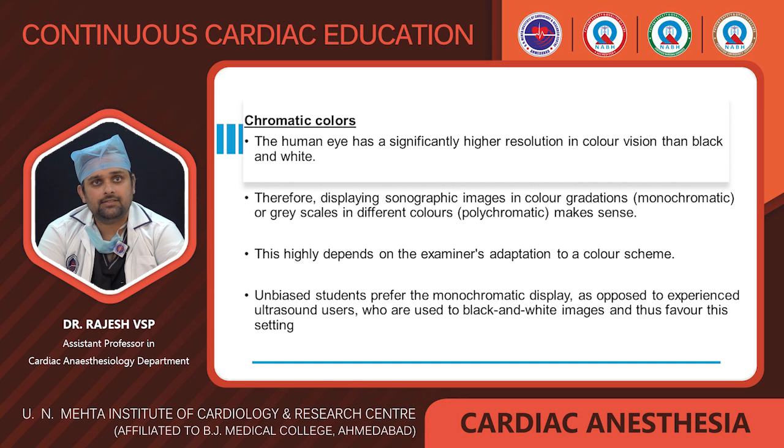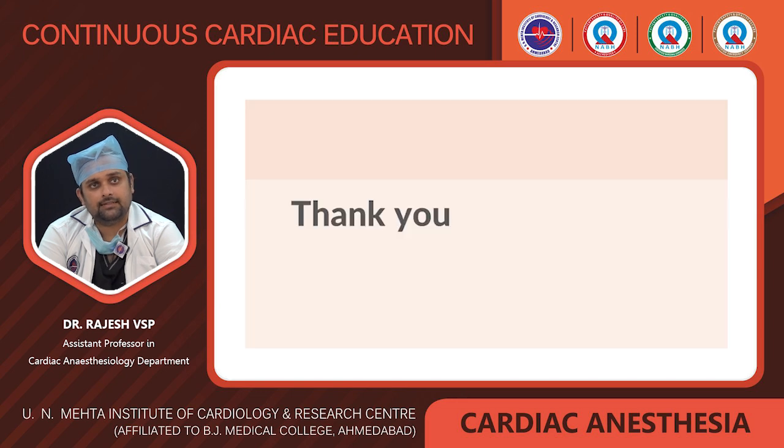Coming to chromatic colors, the human eye has significantly higher resolution in color vision than black and white. Therefore, displaying sonographic images in color gradations, that is monochromatic, or grayscales in different colors, polychromatic, makes sense. This highly depends on the examiner's adaptation to the color scheme. Unbiased students prefer the monochromatic display as opposed to experienced ultrasound users who are used to black and white images, and thus favor this setting. Thank you.